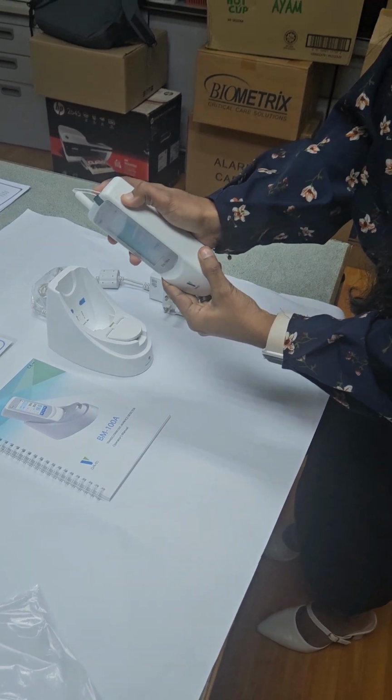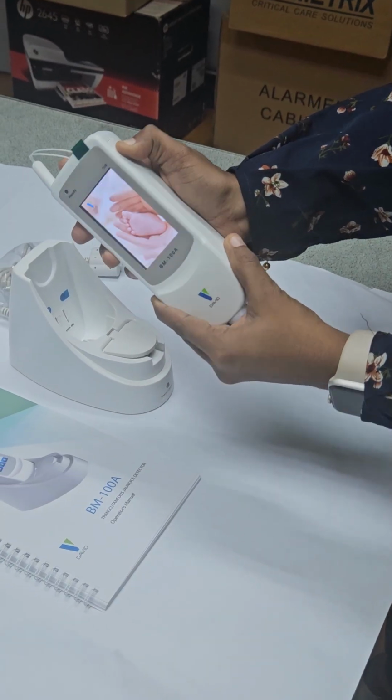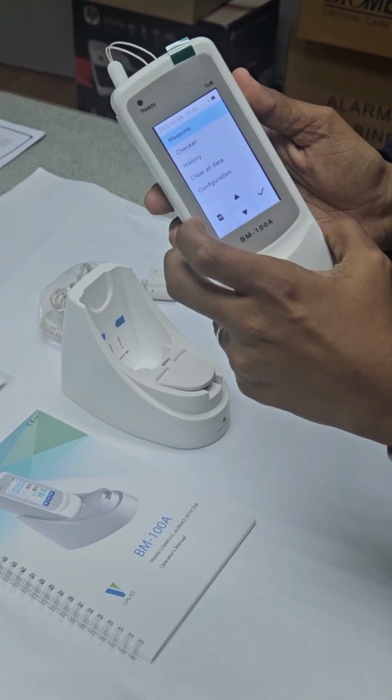Okay, the right key button is the switch on button. Long press for 5 seconds and it will switch on. Okay, once switched on, this is the main screen.